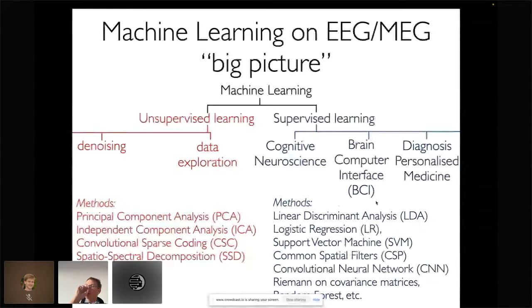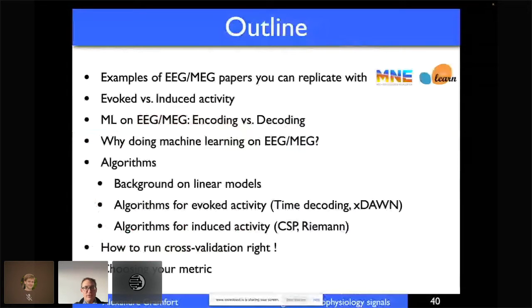All right, so I will start by showing a few papers with some examples. You can just click on the link at the bottom of the slide, look at the tutorial, download the notebook, and run it on your machine or on Colab to replicate the figures.